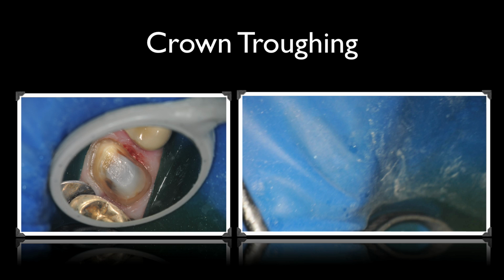Now in this video you're going to see the Picasso light with one of the older handpieces, which is gold in color, and it is used in this particular case at roughly 0.9 watts continuous wave. Now one of the things I tell people to do is when you're concerned with whether you're cutting or not, leave the tip on the tissue. And if you notice it isn't cutting, then I went to the other side.